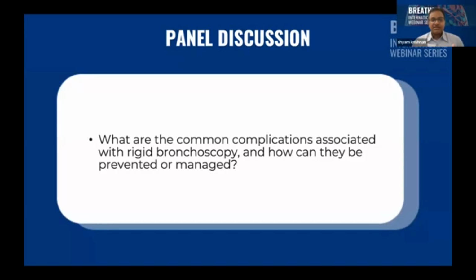The second thing is, you see whether the compression is an extrinsic compression or a dynamic compression. So that is important. If you can, study the CT before you actually go in, or even visualize the airway with an ultra thin or a thin bronchoscope with just local anesthesia before you attempt the procedure. That would do a great world of good, so that you know what you're getting into.